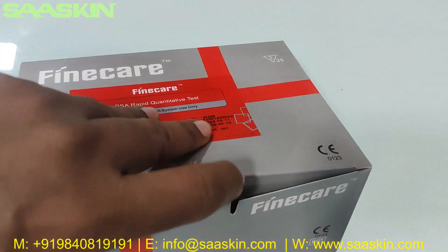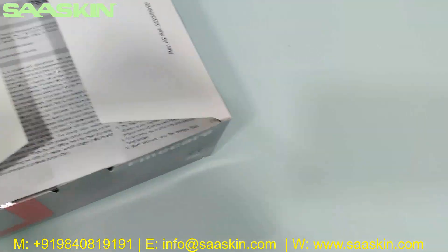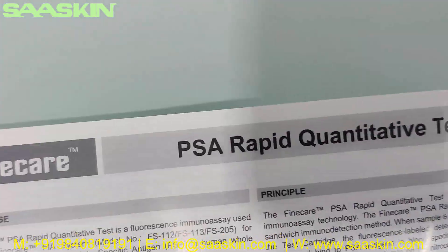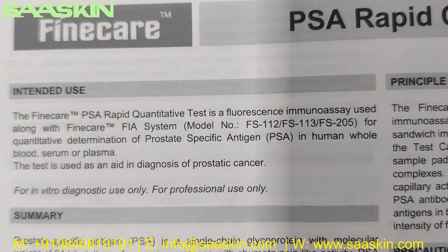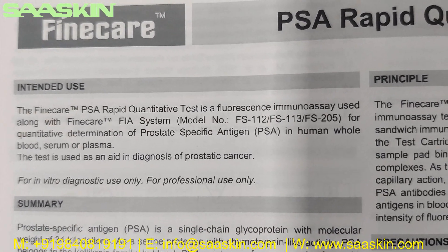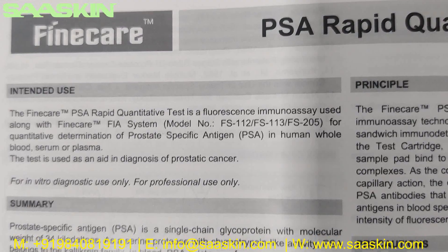I will just unbox this for you. Inside the box you have an IFU brochure. This is the FineCare PSA Rapid quantitative test. The FineCare PSA Rabbit quantitative test is a fluorescence immunoassay used along with the FineCare FIA system for quantitative determination of prostate specific antigen in human whole blood, serum, or plasma.